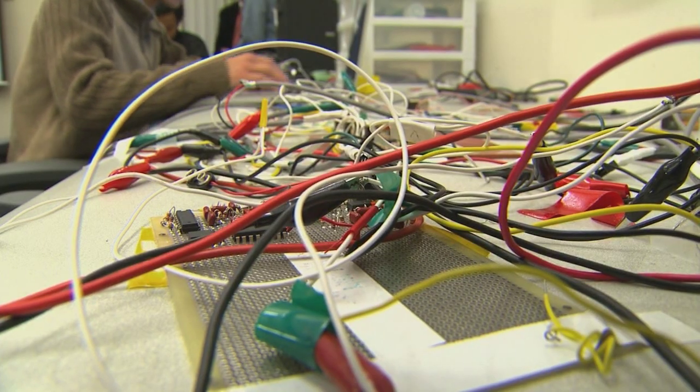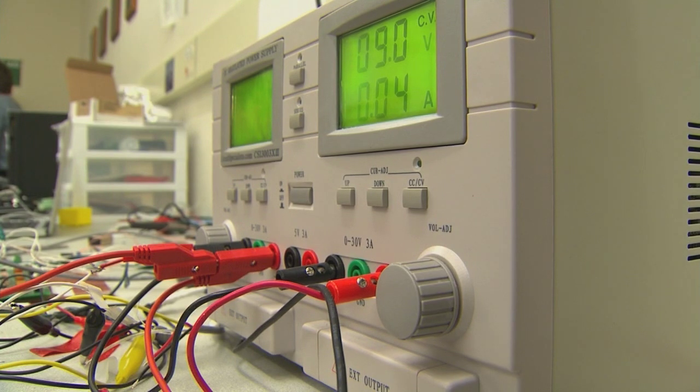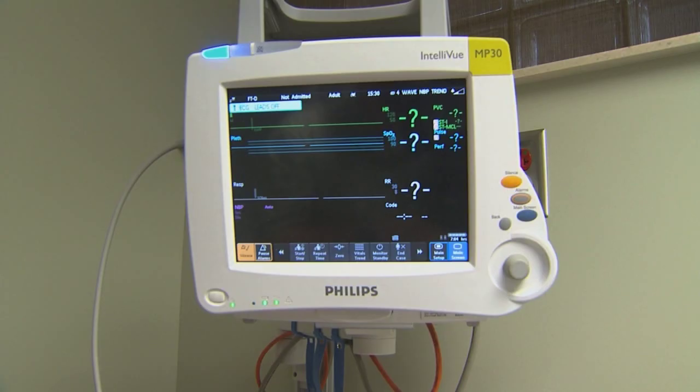So if you think about a human heart, it's essentially an electromechanical pump in many respects. From an engineering standpoint, we could treat it as a pump that's excited by some electrical impulses, and as a result, it responds in a mechanical fashion. The next step, devise tiny sensors to collect the information and continuously transmit it via Bluetooth to a computer.